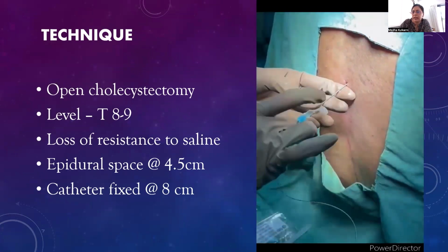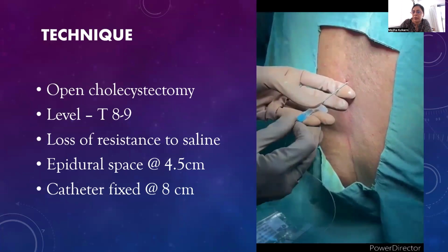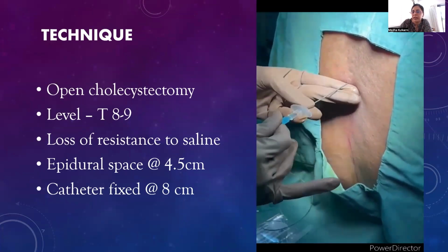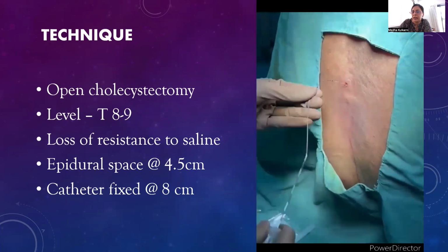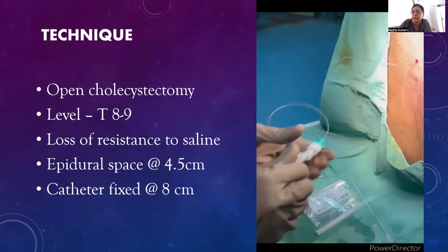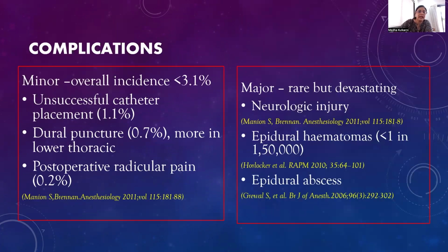It provided a good analgesia for the procedure, intraoperative as well as postoperative. So that's how the catheter was threaded. Gradually, the needle was removed and the catheter fixed. So complications are similar to that in the lumbar epidural.